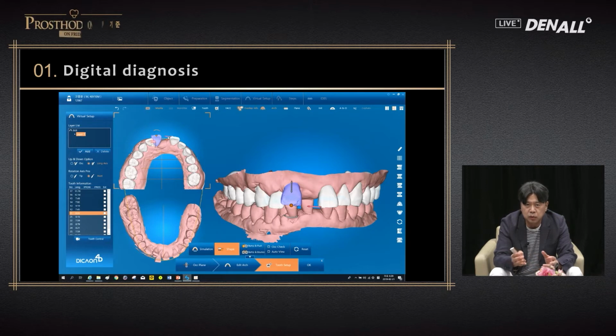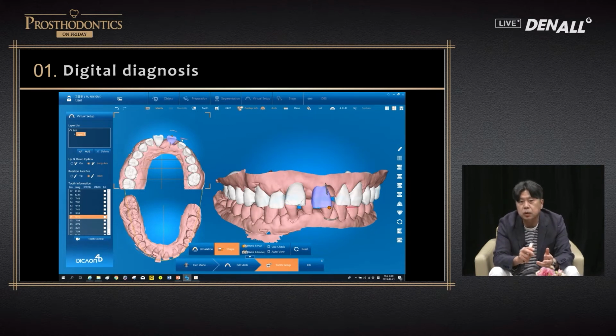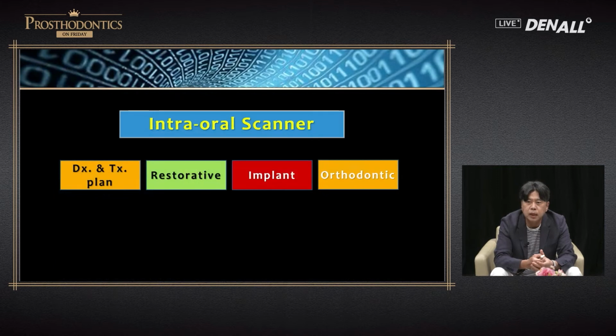If you use the ortho program or a diagnosis program, patient data can be uploaded, a tooth can be extracted or moved, creating or filling a space can be done on the software, and that is used to discuss it with the patient and come up with the diagnosis and treatment plan.